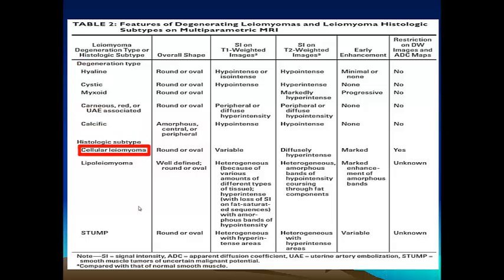So this is very important. If you want characterization of the leiomyoma regarding benignity and malignancy, we must do dynamic contrast-enhanced MRI.